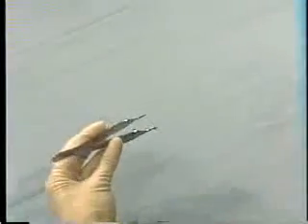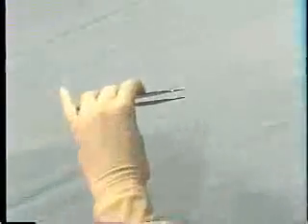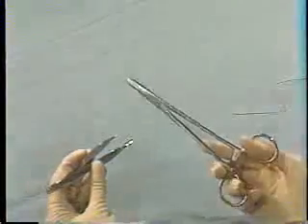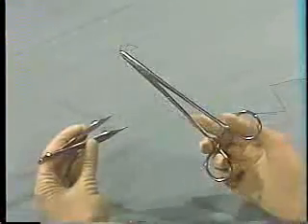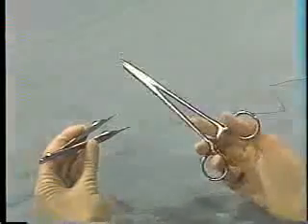Now for the pickups or thumb forceps. Hold them like you would a pencil, with the hand below the instrument like this. Don't hold them with the hand above the instrument. Now you are probably thinking, I have always held the instruments my way and no one has ever corrected me before. Also, I'm used to my way and would be uncomfortable doing it any other way. Anyway, who cares how I hold the instruments as long as I get the job done?